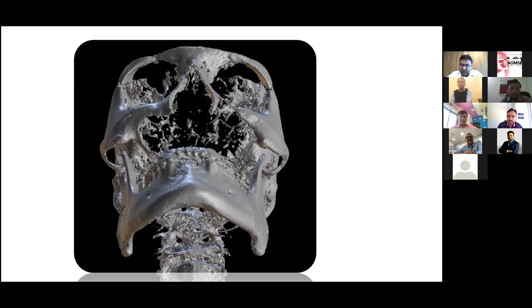So what will be your choice of implant here? PSI or zygoma? I really appreciate the work that Dr. Nihal has done with the PSI implants that have been used. Given a choice, if good zygomas are available, I would still like to be a little bit conventional. Your voice is breaking, if you can come near to the mic. Yeah. So given a choice, I would stay with the conventional zygomas, the time-tested one.